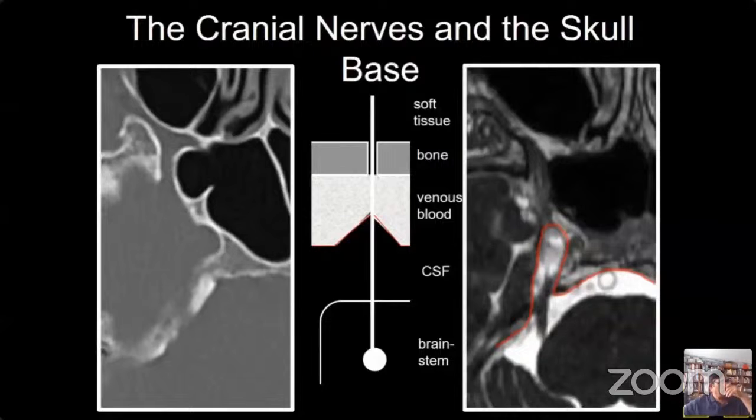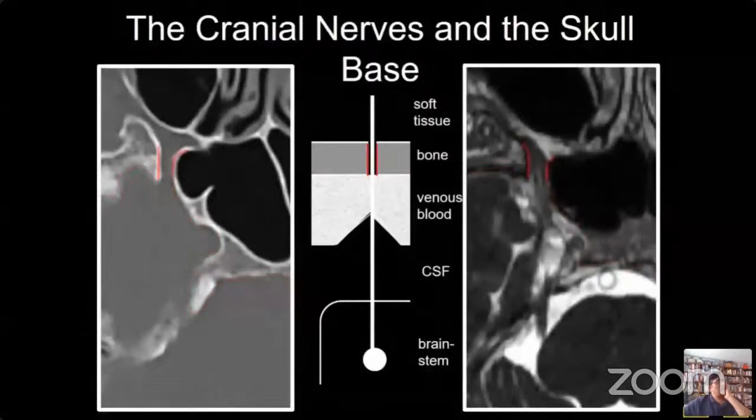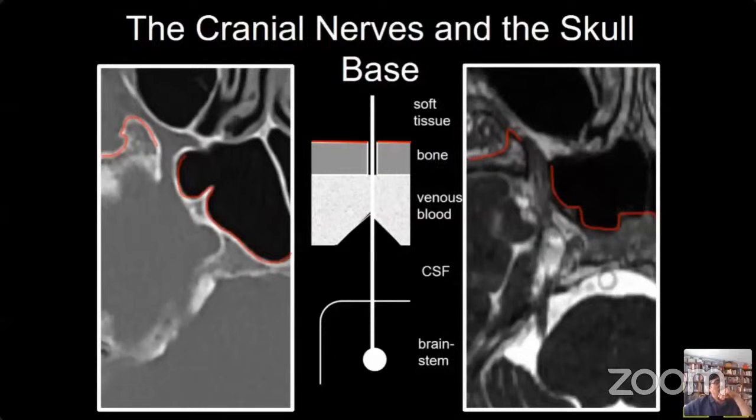Let me see, you may not be able to see my... Okay, so this is the cisternal segment of the fifth cranial nerve. And this is segment D, which is the dural cave segment. This is the Meckel's cave area. And going forward, then you enter the interdural segment, and the fifth cranial nerve goes into the cavernous sinus on the lateral margin, which we will see much better as we go ahead. But I'm just outlining the different parts of the cranial nerve. Going forward again is the segment within the bone, which is the foraminal segment. This is foramen rotundum, seen on MR as well as on CT, and then it gets into the pterygopalatine fossa. And that is the extraforaminal segment that I'm talking about.